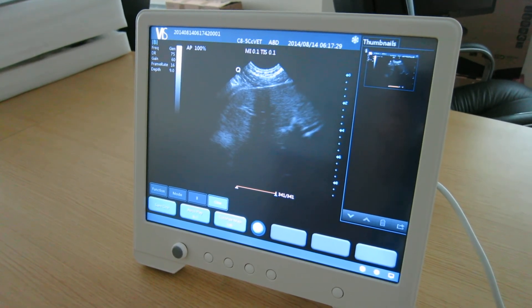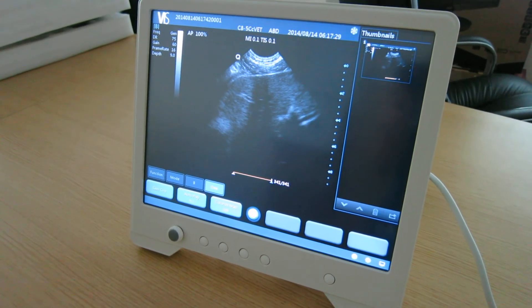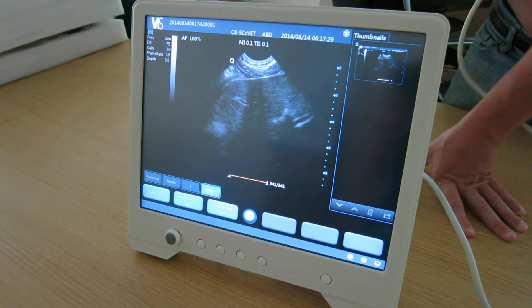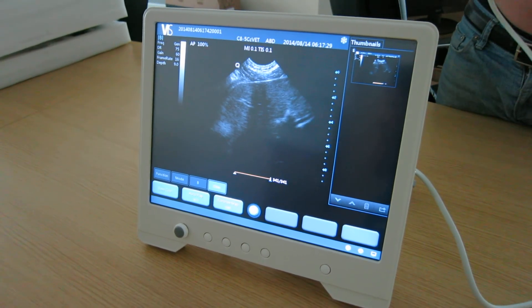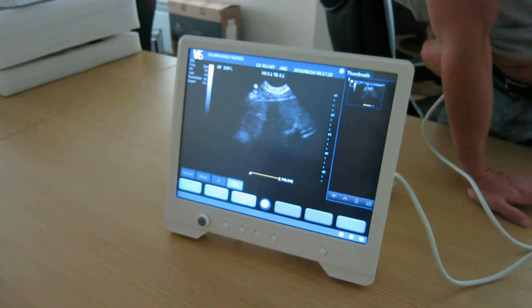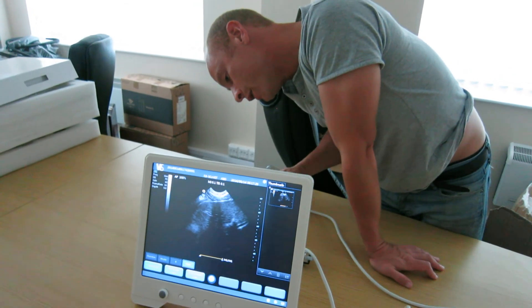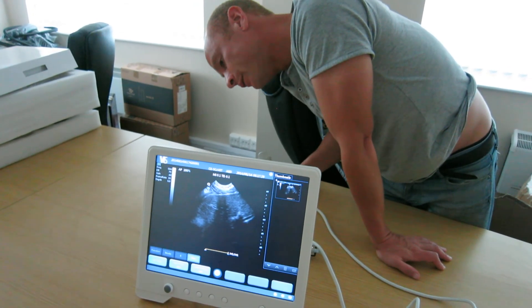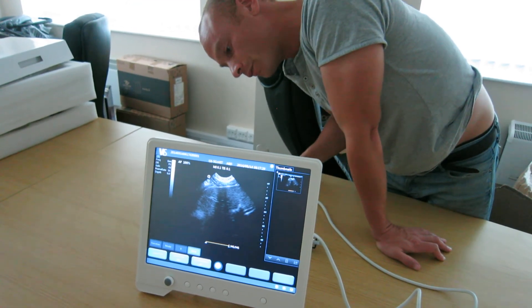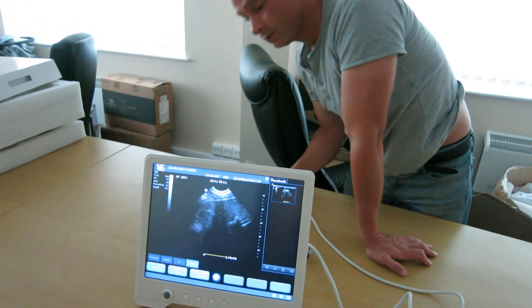It has the ability for USB to take the images off — just on the back has USB connectivity. Also has Ethernet connectivity if required, to be able to take off images via a network. A very simple, easy machine to use.